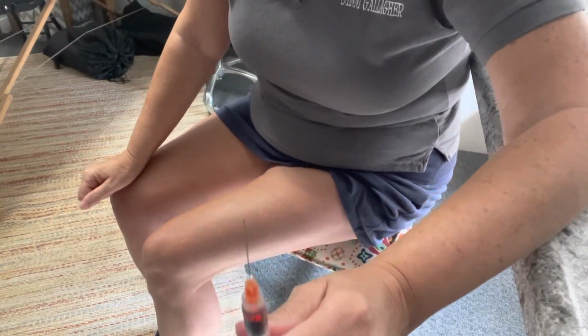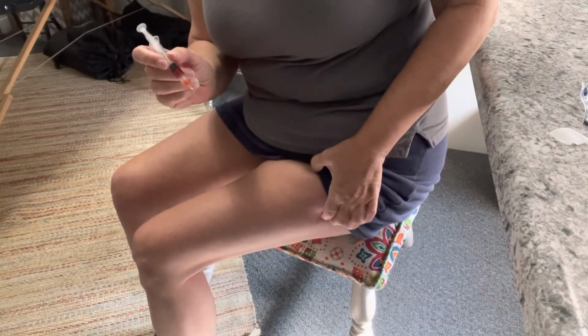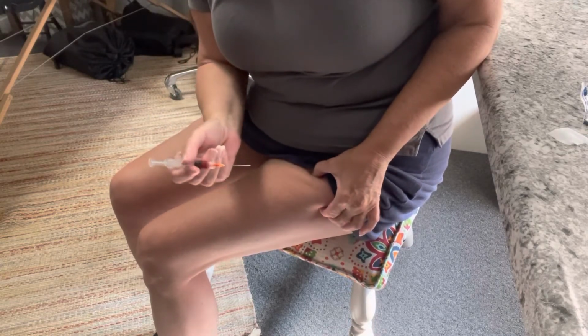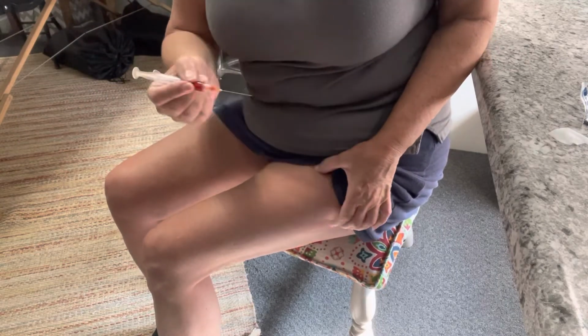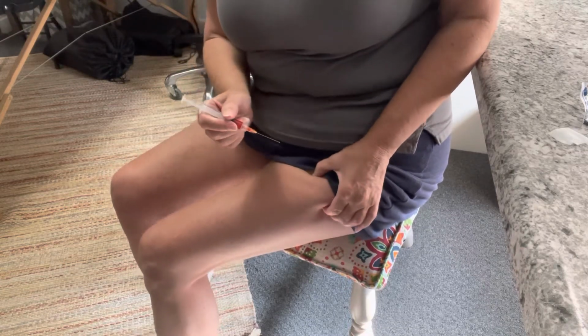So we've alcoholed our leg. We have our medicine and we are ready to inject. So my spot was right here that I alcoholed. Some people prefer to keep one hand here if they're giving the medicine while someone helps them draw it up. Or you could draw it up ahead of time. And that way, once your alcohol is dry, you can inject.